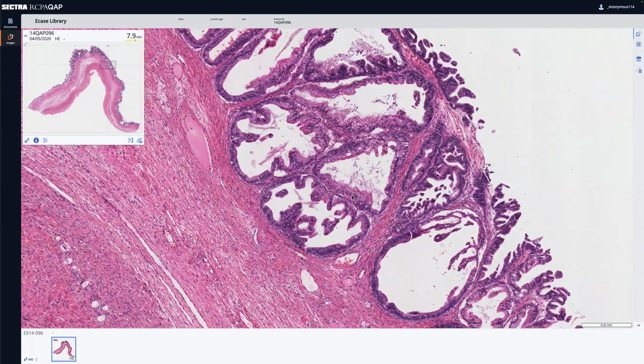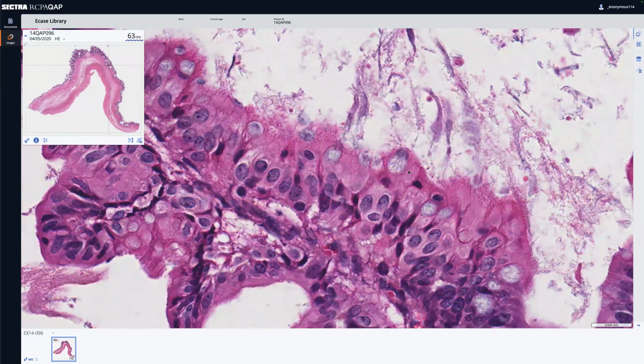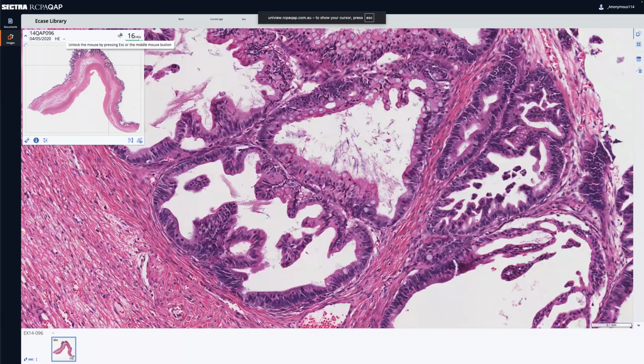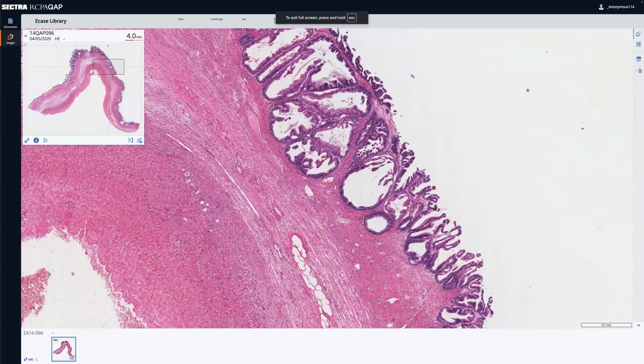all right, around here, this makes it easier, doesn't it? These are goblet cells. So, Diane, you're going to say, but you can get mucinous metaplasia in endometrioid carcinomas. And I say, yes, you can, but they don't have goblet cells in them. So the key to diagnosing a mucinous tumor of the ovary is to find those goblet cells. Now let's just move things around.